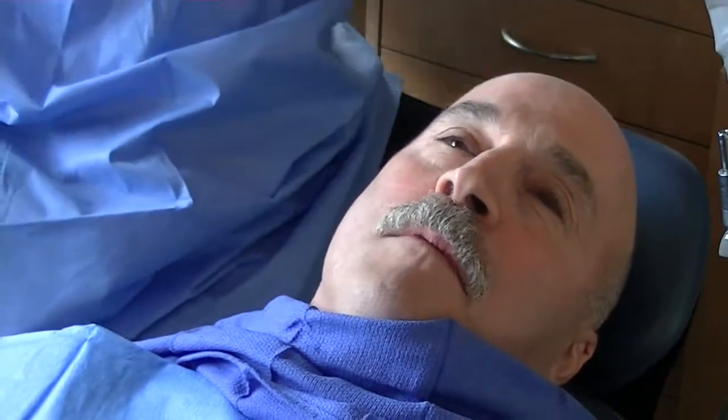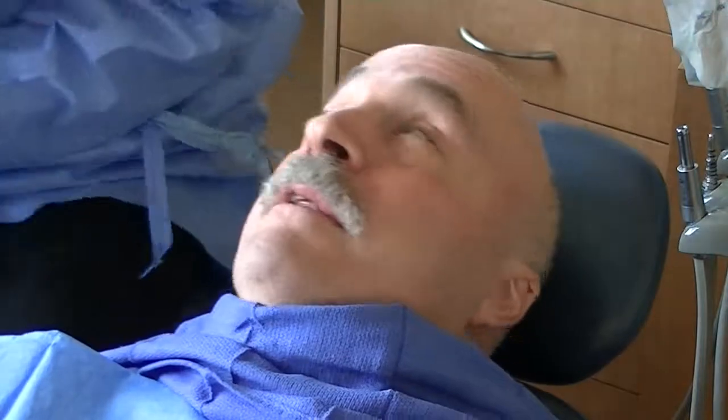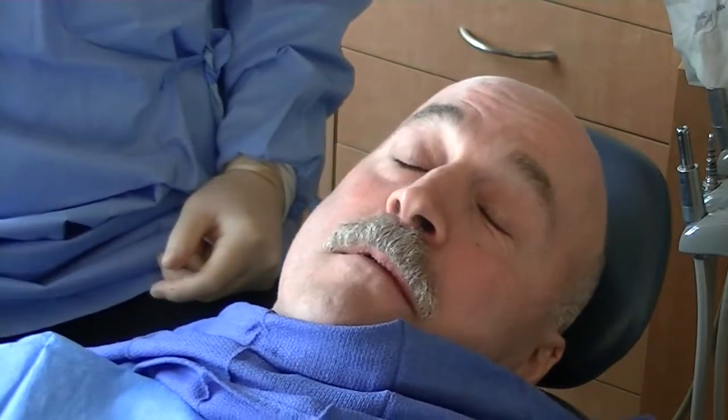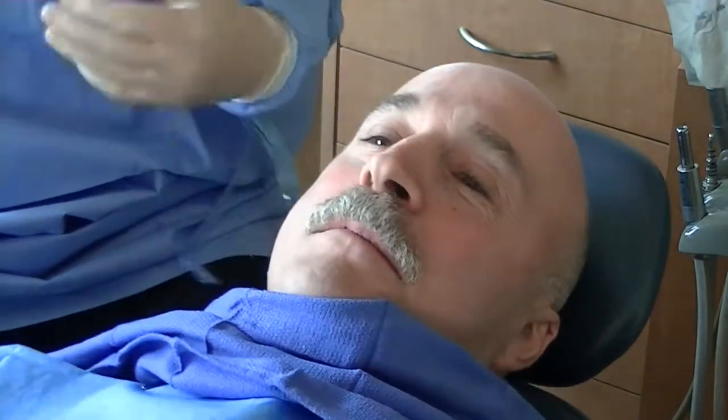Did you feel anything special? Pushing, tugging, pain, discomfort? No pain, no real discomfort. Of course, there's pushing, and like I say, the sounds when you were drilling into my jaw. That might be the only thing that patients might find objectionable. Okay. But if you had some headphones, that would be good too, right? Yeah, that would probably be helpful.